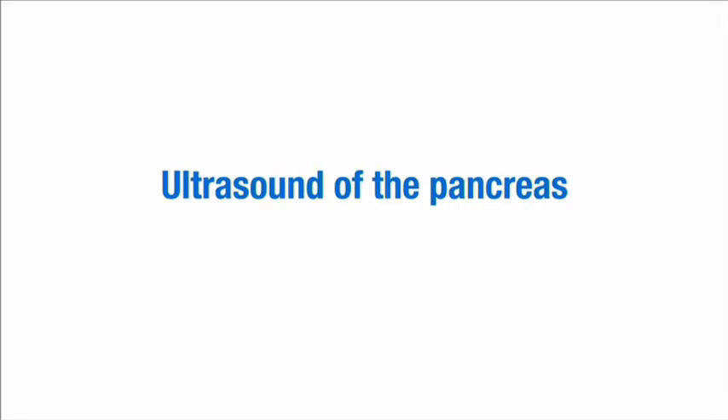This video demonstrates how to set up and perform an ultrasound scan of the pancreas.